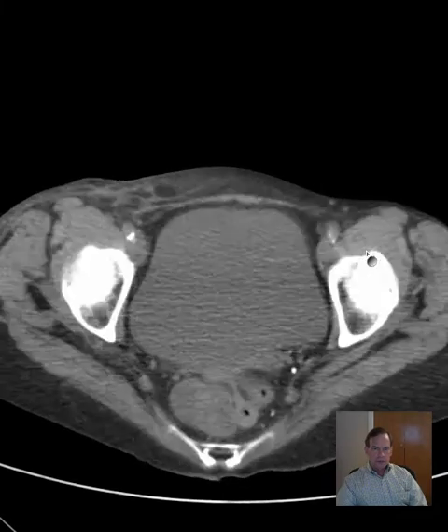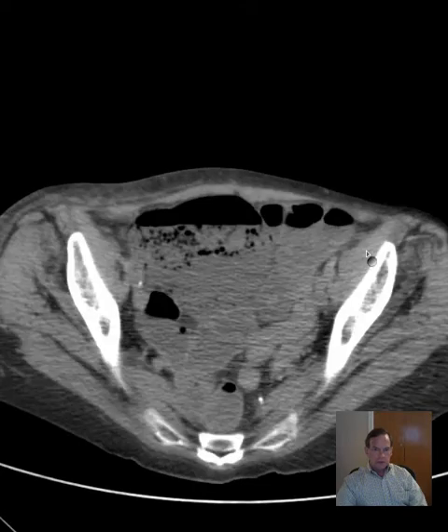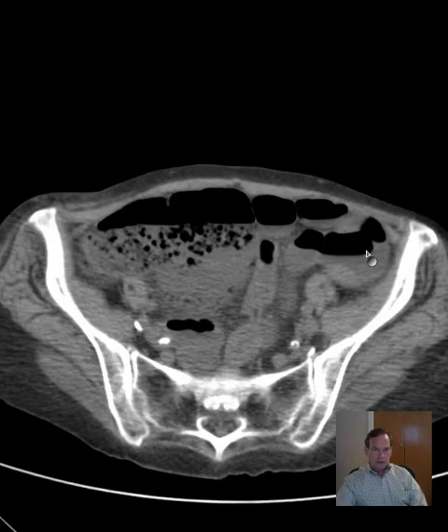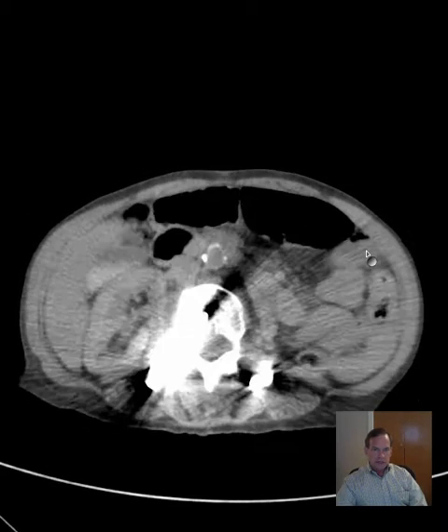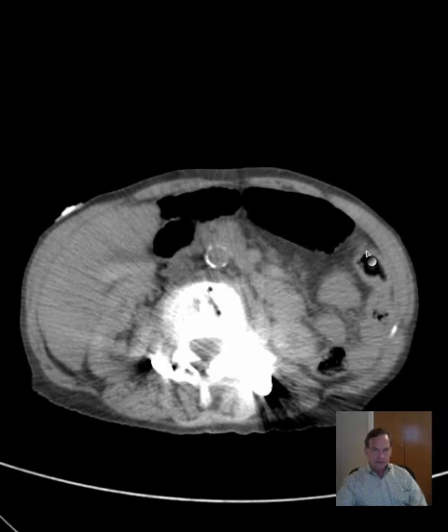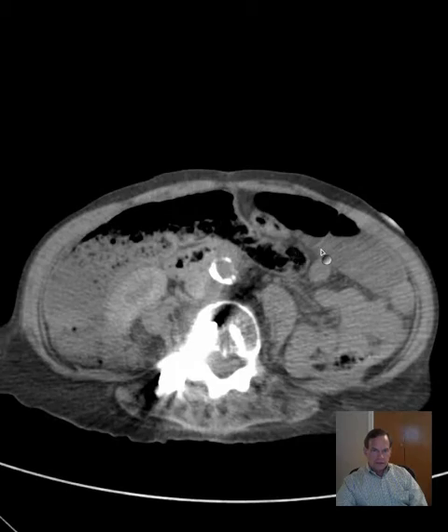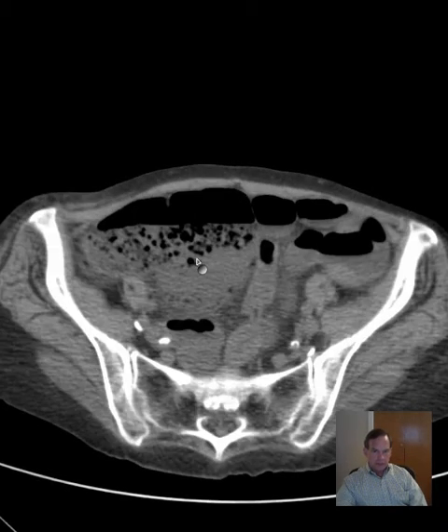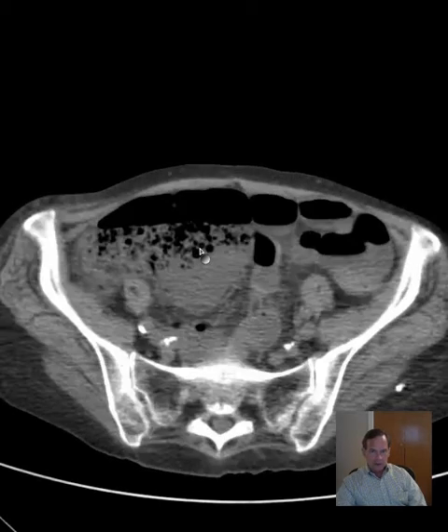I'll scroll through here to just give you an overview of what we have. I'll go a little more slowly back up, and you can see the limitation of the study because of the lack of IV contrast and oral contrast. We do not see the delineation of bowel loops as clearly. You can see bowel and where bowel is and bowel content, but it's a little harder to identify what part of the bowel you're looking at.